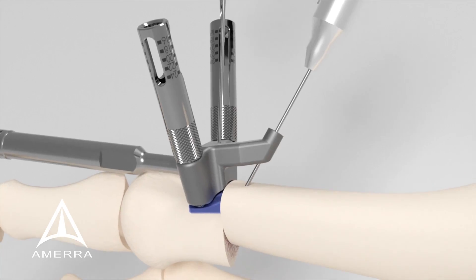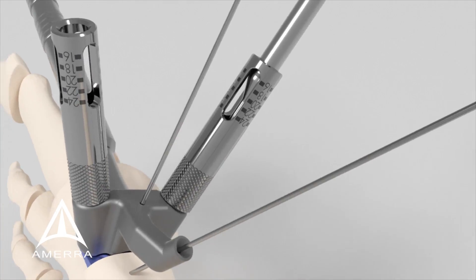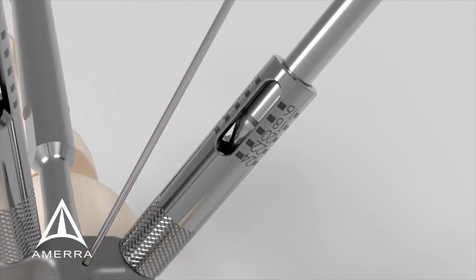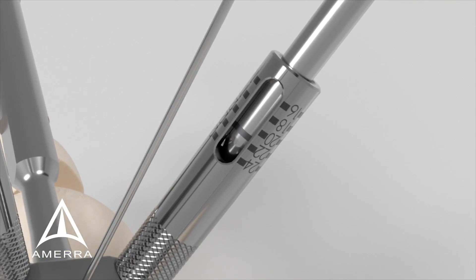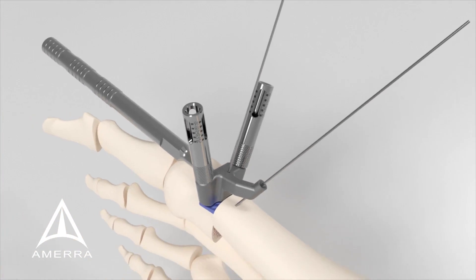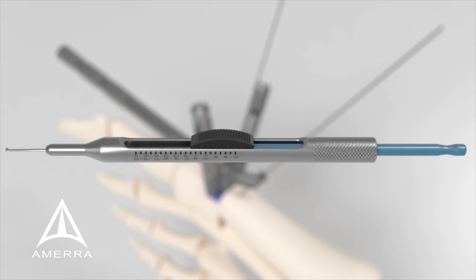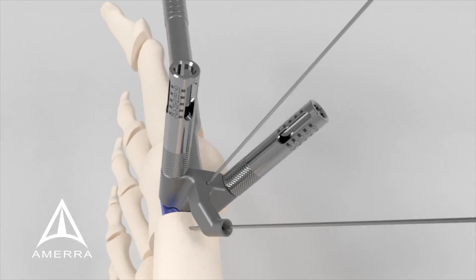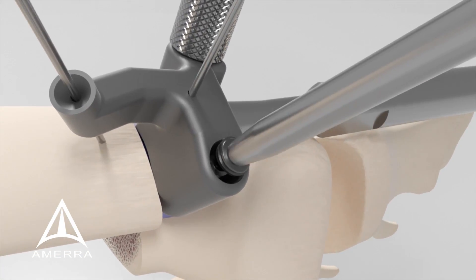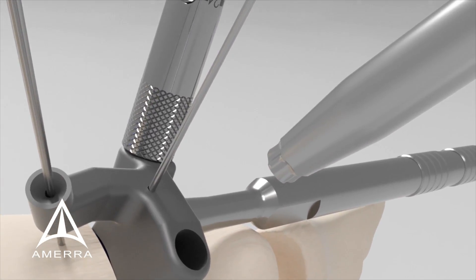Pilot drill through one of the threaded drill guides for distal screw placement. Utilize the calibrations on the threaded drill guide and calibrated drill bit to determine the necessary screw length. If calibrated measuring is not preferred or possible, then the depth gauge may be utilized. Remove the threaded drill guide and insert the appropriate length locking screw into the pilot hole through the plate placement guide using the driver bit.